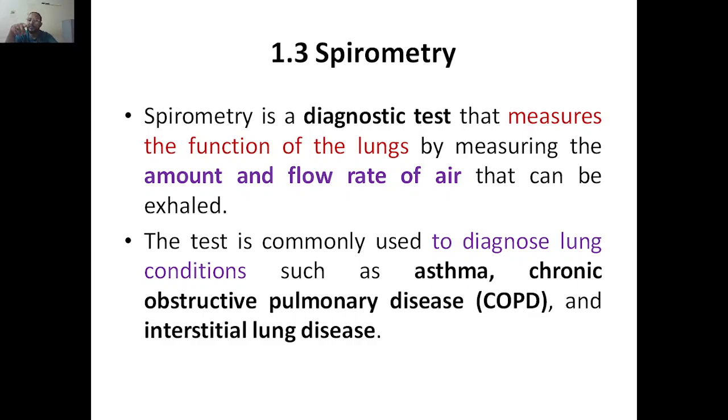The same thing went for the heart, we had ECG. Similarly for our lungs we have spirometry, which can tell us whether the lung is functioning normally or not.